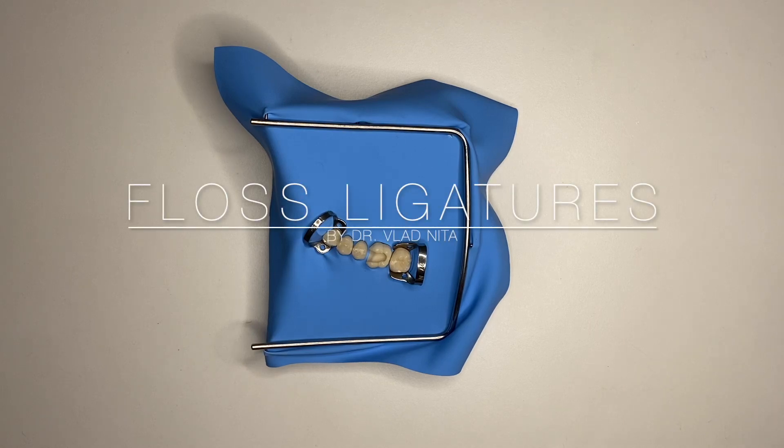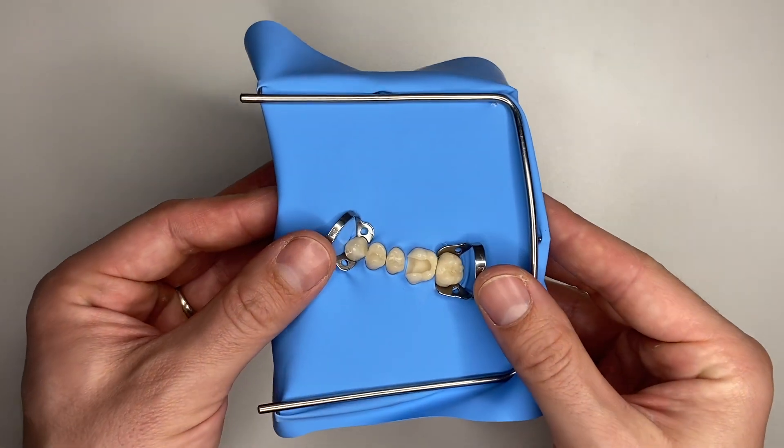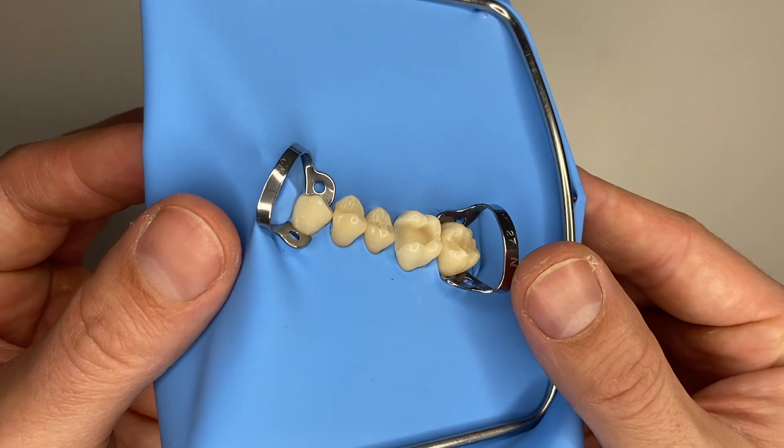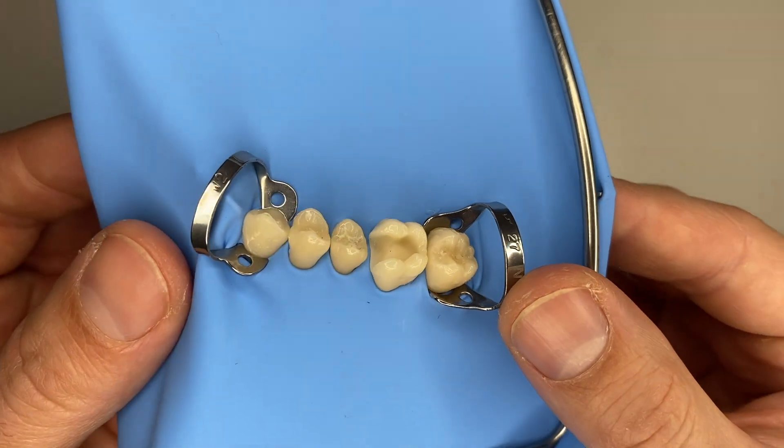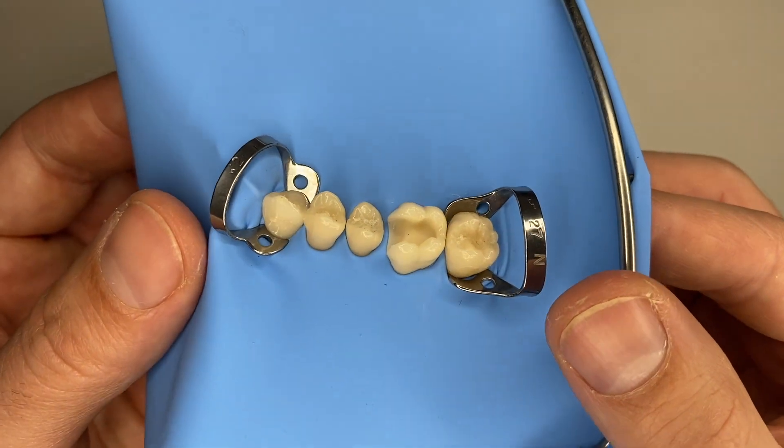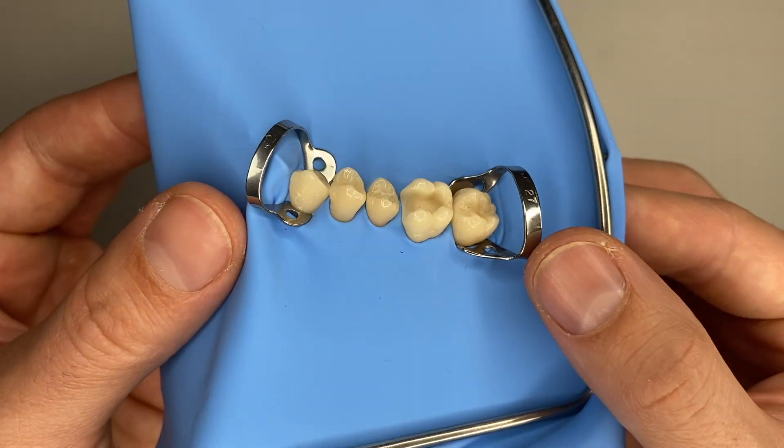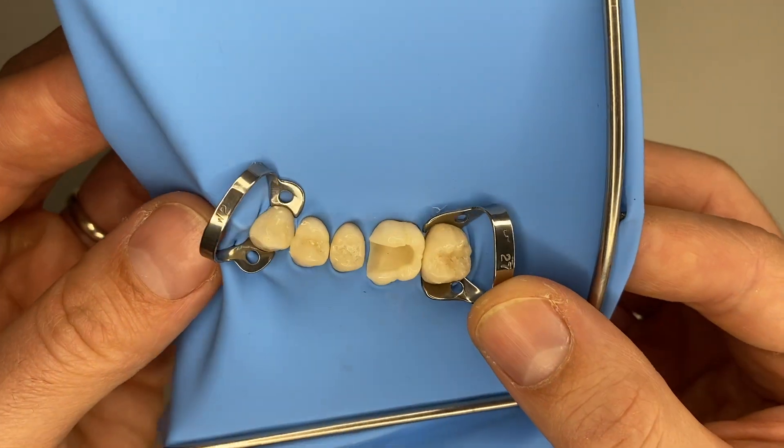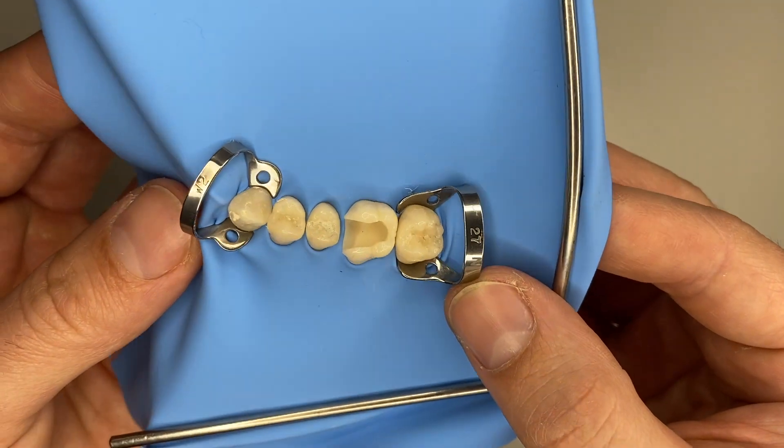Hello everyone and welcome back. One question that keeps popping up is if I ever use ligatures, and the answer is yes. You're not going to be able to isolate like this every single time. You're going to have cavities that go pretty deep, perhaps underneath the gingival margin, so you're going to need extra tools at your disposal in order to invert the dam like I have done here for a specific cavity.